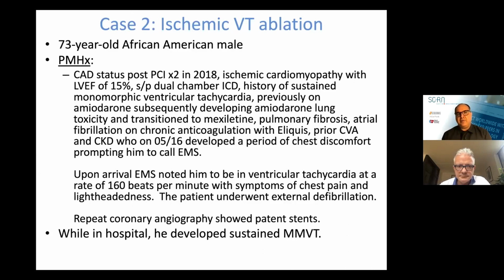ICEs almost never have a problem. Obviously, in medicine, we never say never. If the patient has some anomaly and it doesn't go up, then you use fluoroscopy. Over the past 3 years that I've been doing this, I had only 2 cases where I had to use fluoroscopy because I was worried that the patient had some unknown obstruction, maybe a filter or something that was not mentioned in the history.